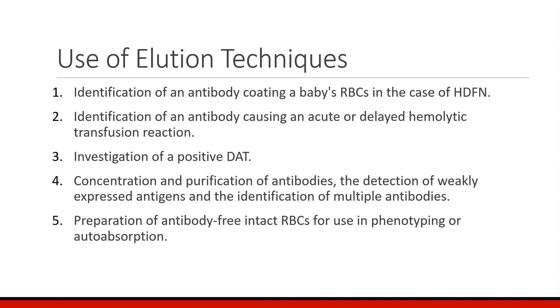It's however the patient and however many other donors that are mixed in with that patient. So again, an alloantibody can be formed. It will attach to the donor cells because that's why we're making it. So we can go ahead and do an elution procedure, and the antibody that we're recovering comes from the donor cells, not the patient, but the donor. And when we get to delayed transfusion reactions, we will talk about this again.